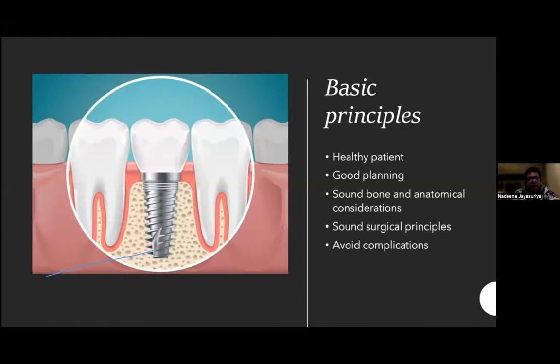So this dentist, he had forgotten to change the settings from the fast to the slow when he was about to insert the implant into the patient's already made osteotomy in the bone. So what happened? He turned the pedal and it turned very fast and the implant went flying. He had only one implant on that day because he doesn't do a big practice.